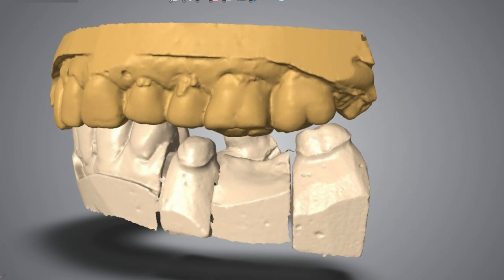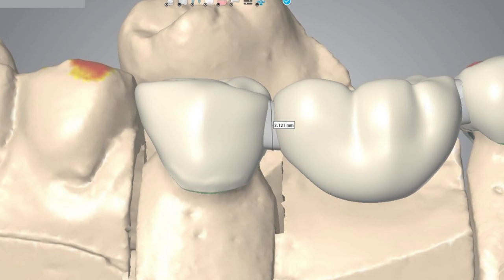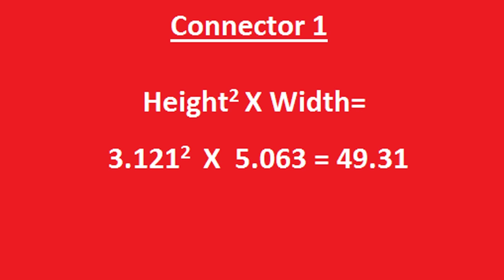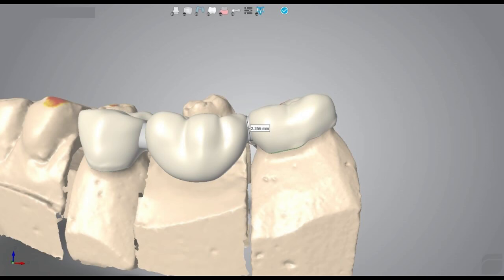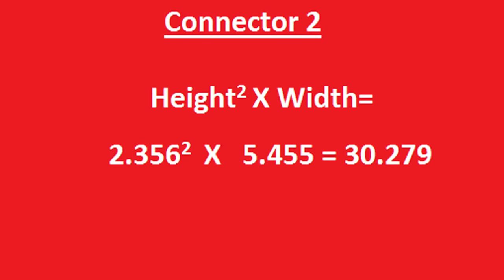This is another case that I have. I don't really have the models as this is an old case, but just to show you I have the scanned images and this is the three-unit bridge which we designed in the software for this particular case. This is the first connector which has a height of 3.121 mm and it has a width of 5.063 mm. The calculation for this connector — that is the height squared multiplied by the width — is 49.31 mm, which is more than 27 mm, so it looks like a sound connector and will pose no issues as far as the strength goes. The second connector has a height of 2.356 mm and the width is 5.455 mm. This value comes up to 30.279 mm, which is just above 27 mm, so we are safe here.